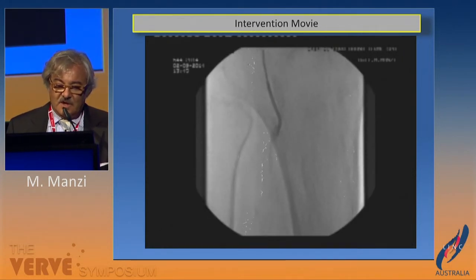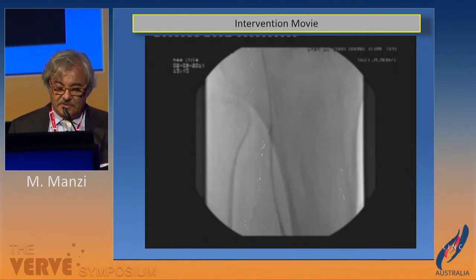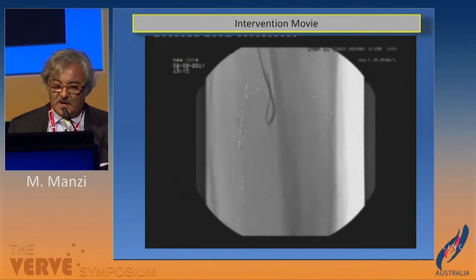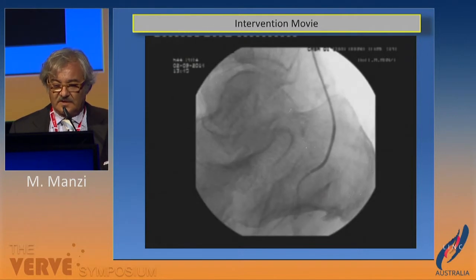There is a stent, so leaving the CXI catheter as a marker close to the supposed origin, it was possible with an antegrade Bernstein and a new V18 wire to go down and snare the wire from below, as we normally do, and we saw Andre doing so many times. So after snaring the wire, it was possible to advance the Bernstein catheter to the heel.